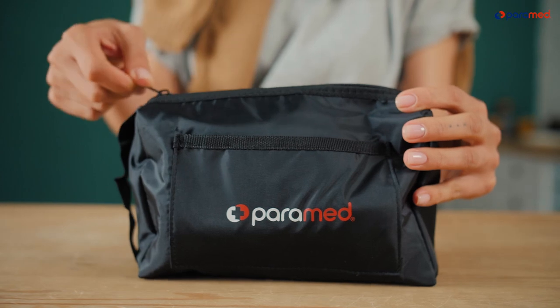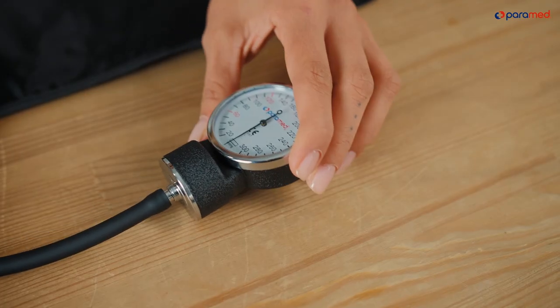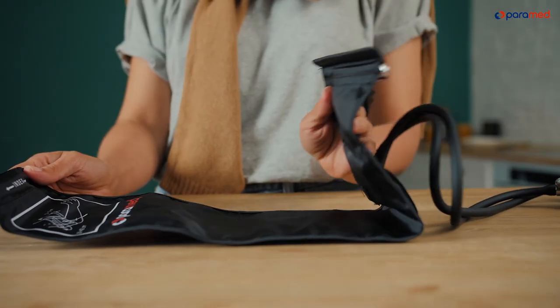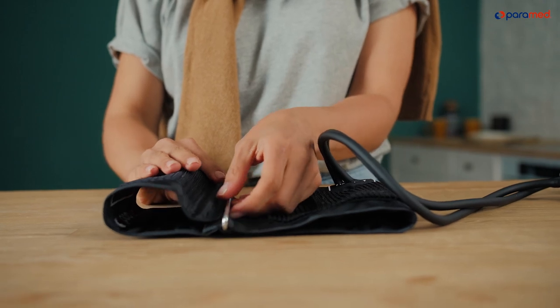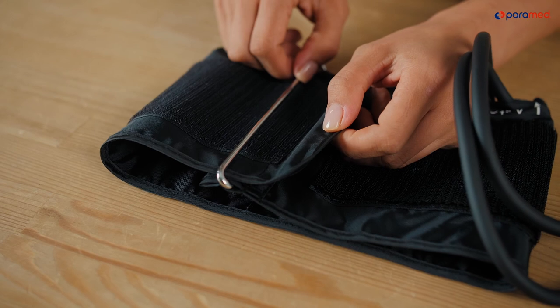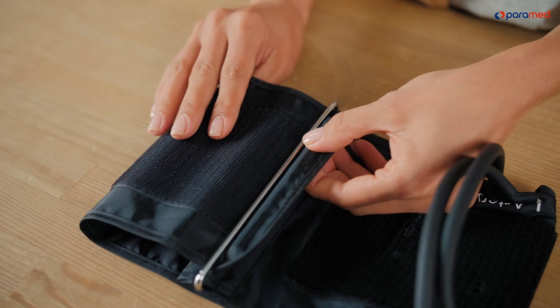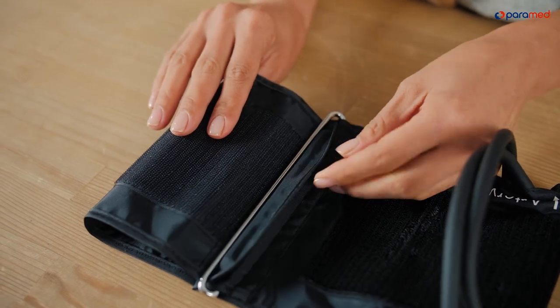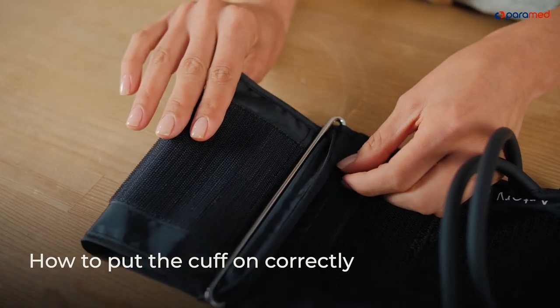The device must be assembled prior to use. Attach the manometer to the cuff using the tubes. We also recommend inserting the cuff's edge into a special D-ring. Do not touch it after completing this step. Place the cuff in front of you so that the ring is in front, and insert the cuff's edge so that it's inside the ring. The special seal on the edge will prevent the cuff from falling out of the ring.